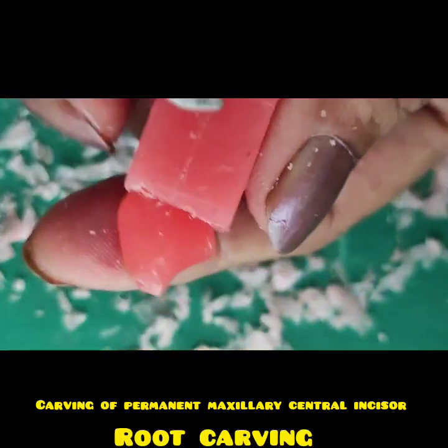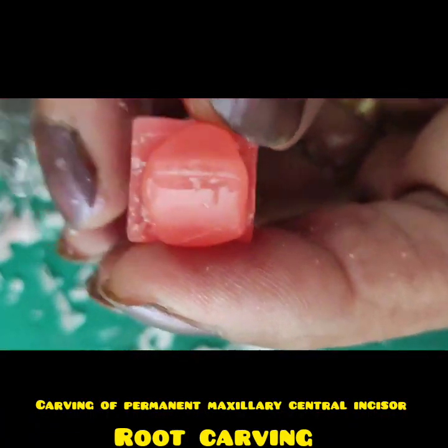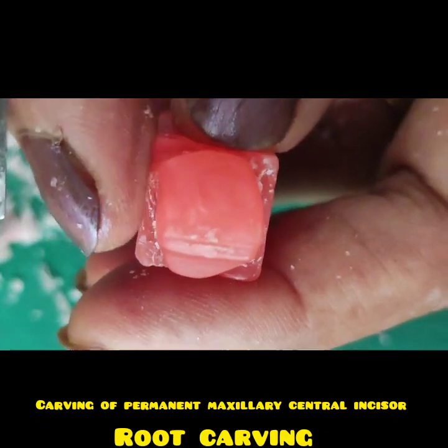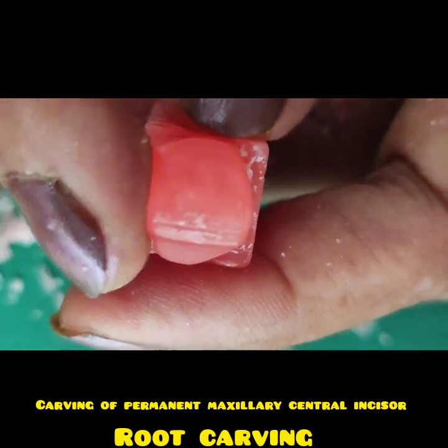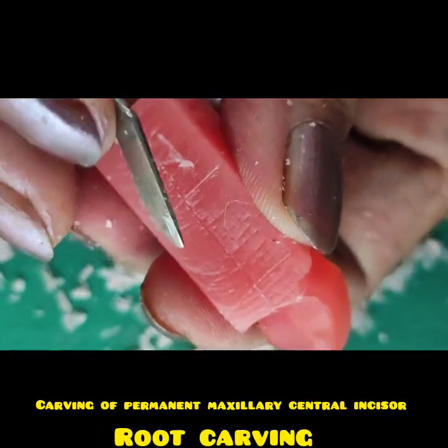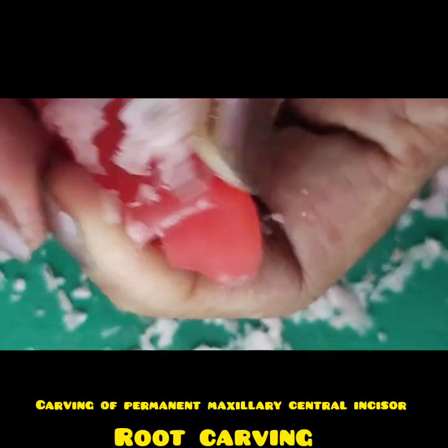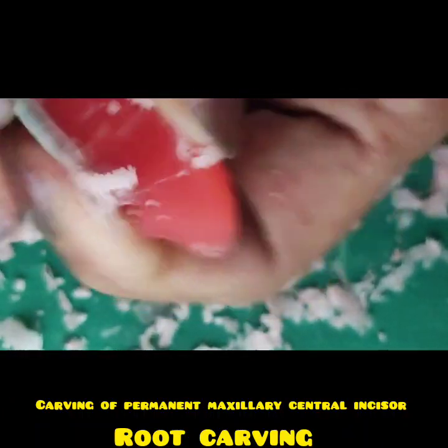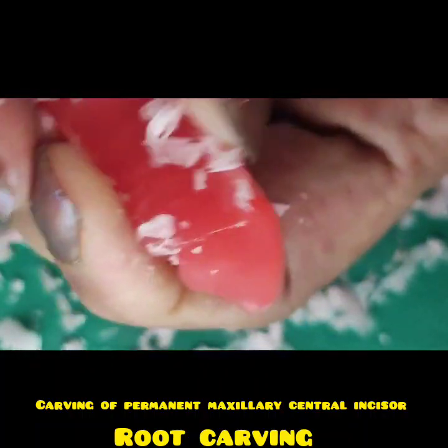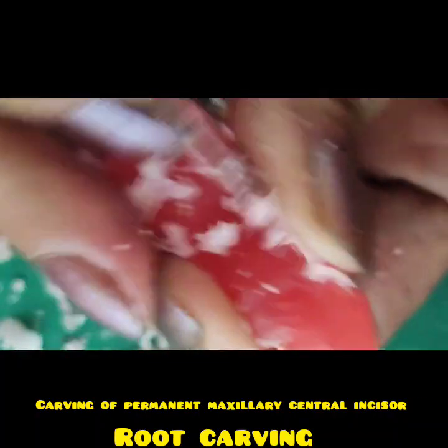Now let us begin with the root. Before I start the root, I will first reduce all this extra layer of wax and reach till the crown surface. Now I can use the cutting edge of the carver and move horizontally from my thumb to the index finger. I will hold my block vertically and move horizontally.